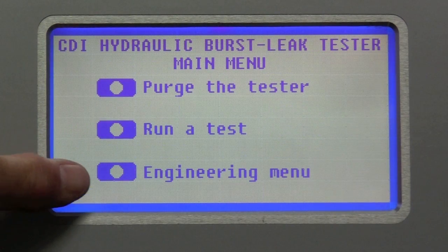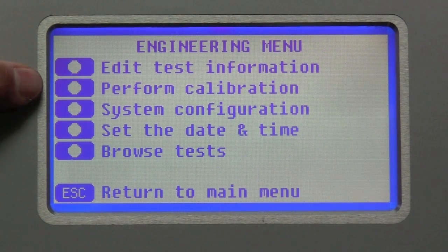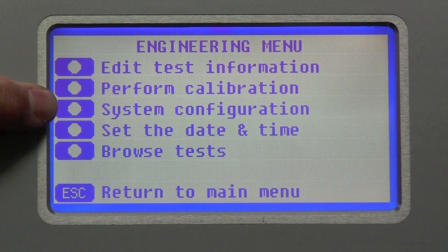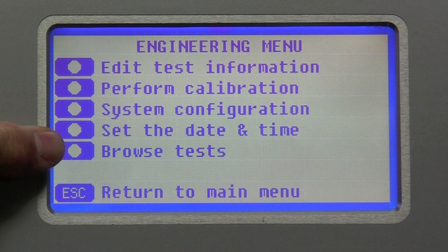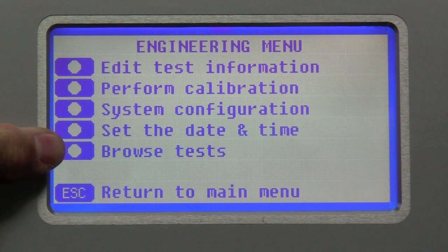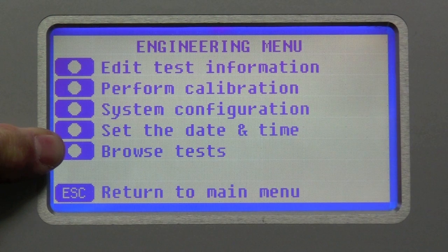And then the third choice is the engineering menu. Here you have edit test information, perform calibration, system configuration, set the date and time, and browse the tests. Here the operators can browse the tests without being able to change anything if the password has been implemented.